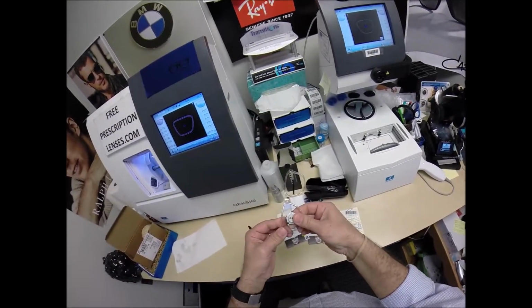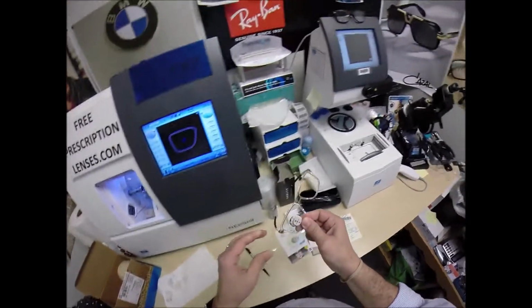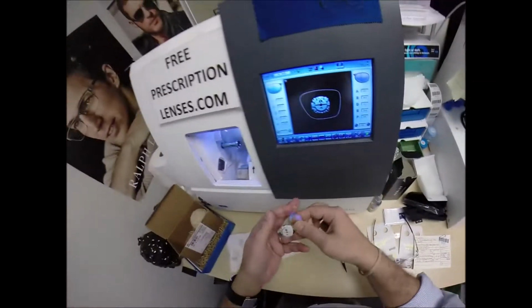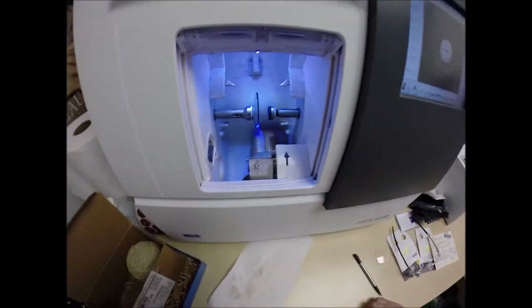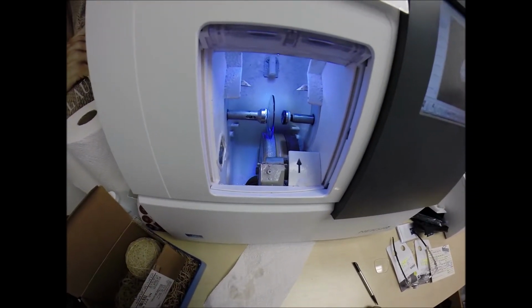So we're going to tuck this in at the outside corner, push down the nose, it snaps right in. We're going to flip this over to L, which is Latin for not right. Place the magnet into the Chuck, the Charles, the Chucky baby. Or today I should call it the Wilson, but I'm not. I'm calling it the Rhea, because Rhea is what's holding everything together.